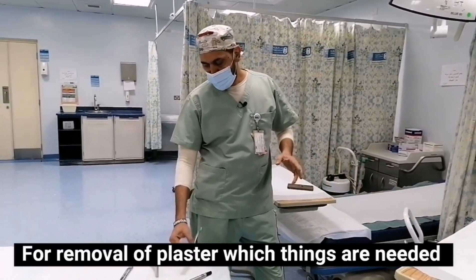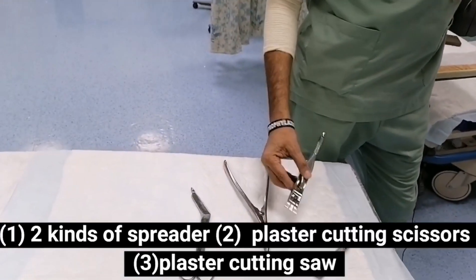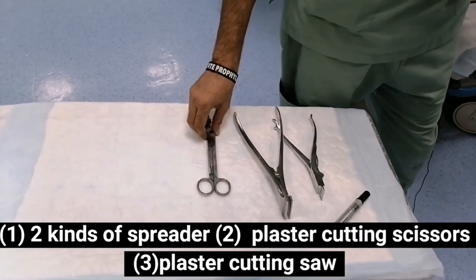For the removal of plaster, these things are needed. Number 1: two kinds of spreader. Number 2: plaster cutting scissors. Number 3: plaster cutting saw.